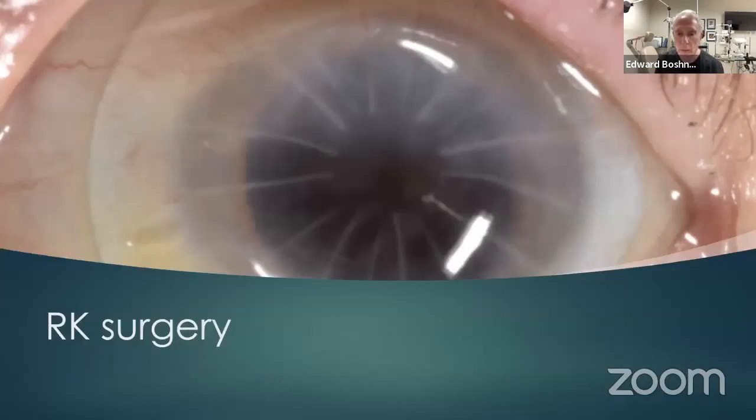RK surgery was very popular from about 1985 to 1993. And with the advent of LASIK surgery, very few people do that anymore. This is an iPrint lens over a post-RK cornea. You can see all the cuts. This patient has no functional vision with his eye until we fit this eye with a scleral lens.